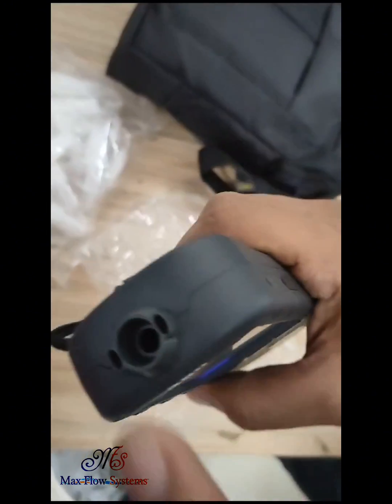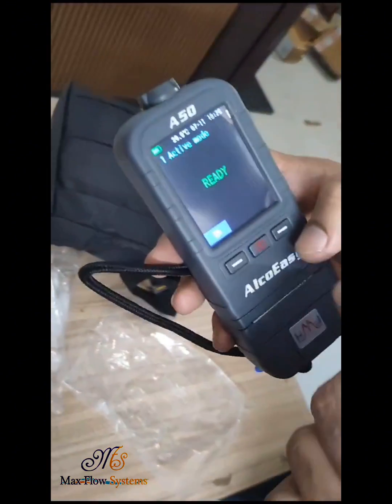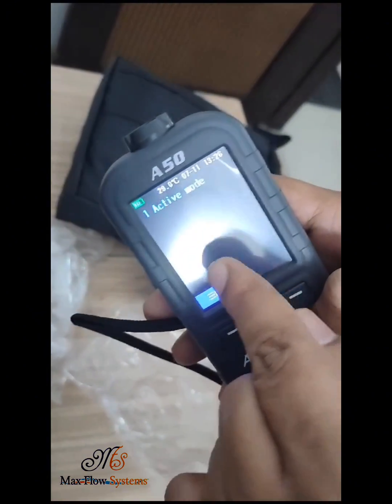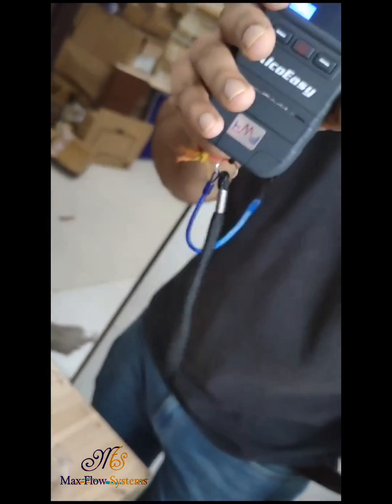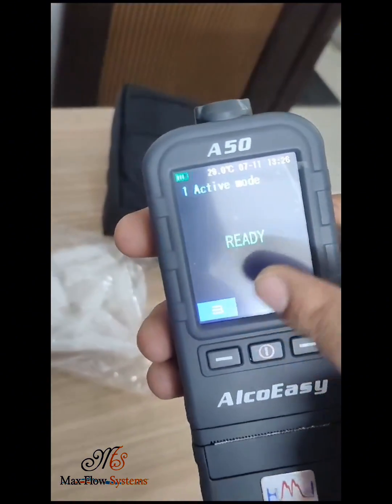You have to blow into it with the help of a mouthpiece or without a mouthpiece. As you can see, I blew for just two seconds and it showed an error — blow failure. Then I will again blow on the alcohol tester, but you can see the blow again shows failure.